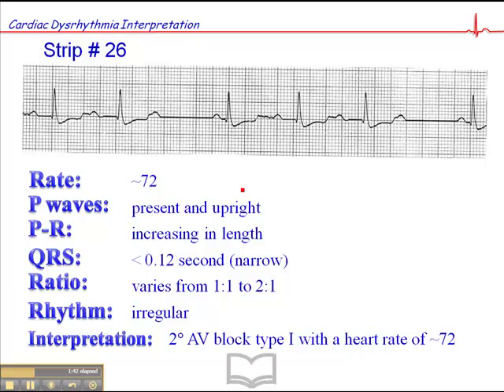The key here is to look for the dropped beat. Here's the P-wave that stands alone, and the PR interval before it is long, and the PR interval after it is short. That's the classic 2nd degree AV block type 1, or Wenckebach — dropped P-wave with a prolonged PR interval before it, and a shorter PR interval after it by comparison.